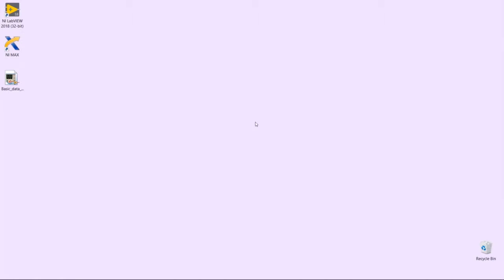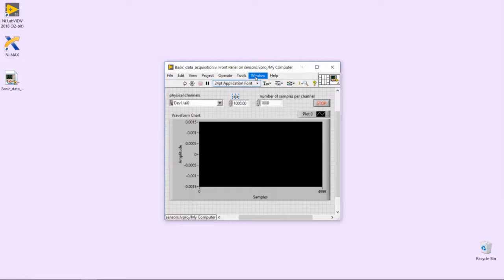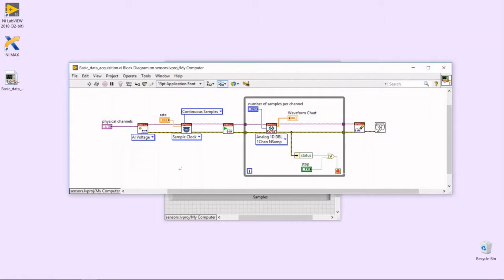In the previous video, we showed you how to make a basic data acquisition application. We're going to use that application as a starting point for today's lecture. Let's open this application and go to the block diagram to see which elements we have there. So we have all the elements that are necessary for acquisition, that is create channel, timing block, start the acquisition, read the data, clear the task, and error handler.